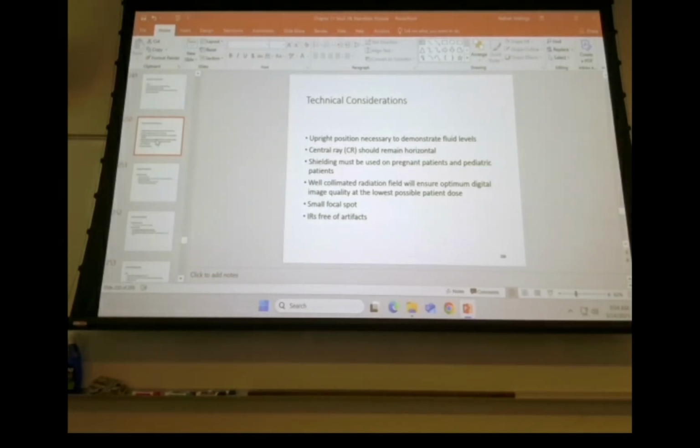Okay, so if you have your textbook out, look on page 96. You remember when we first started covering chest x-rays, if we wanted to see a pleural effusion, what did we need? Decubitus, right, we needed to see decubitus. And what are the steps, what makes a decubitus image? Horizontal central ray, somebody said it.